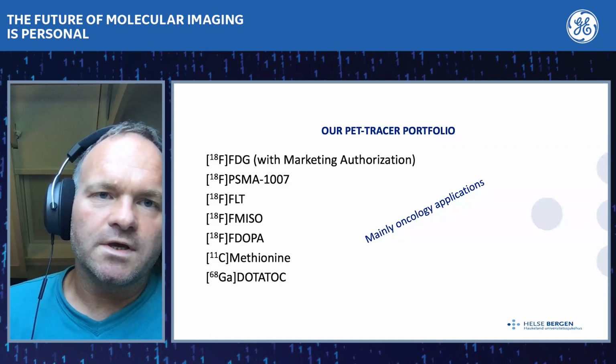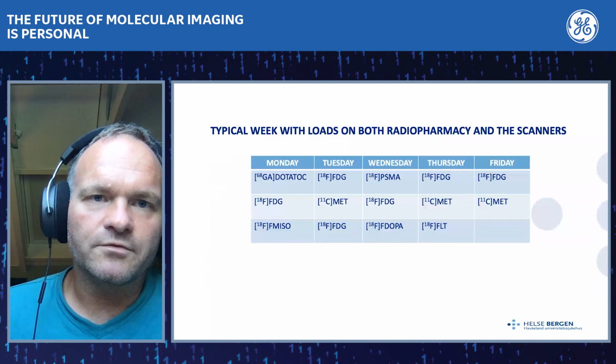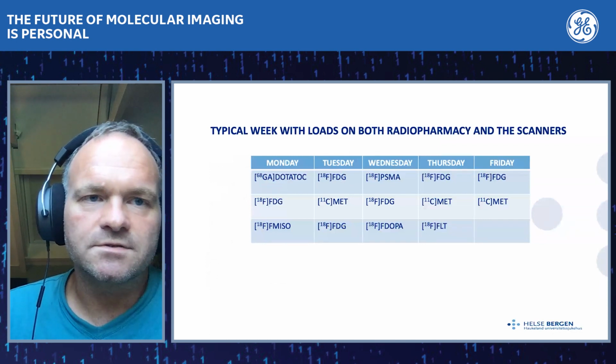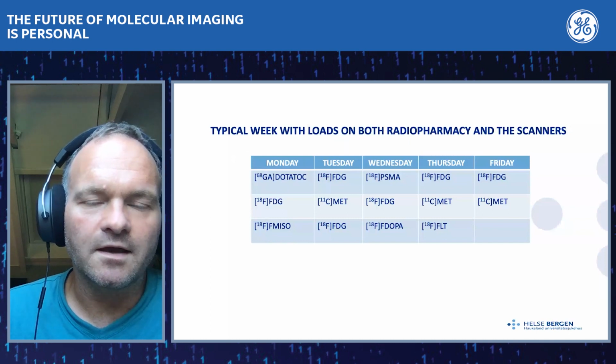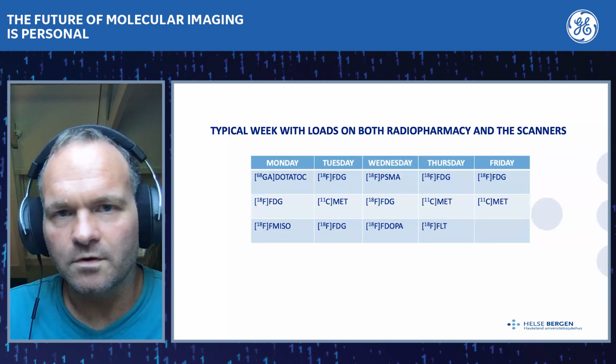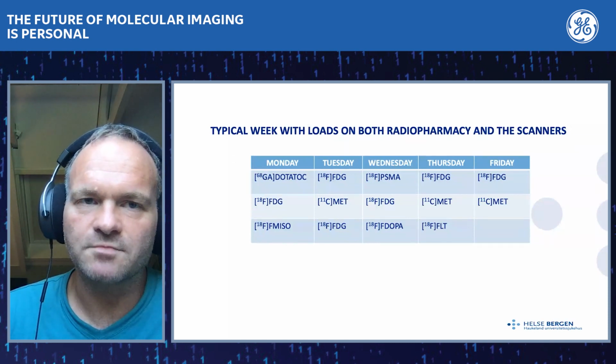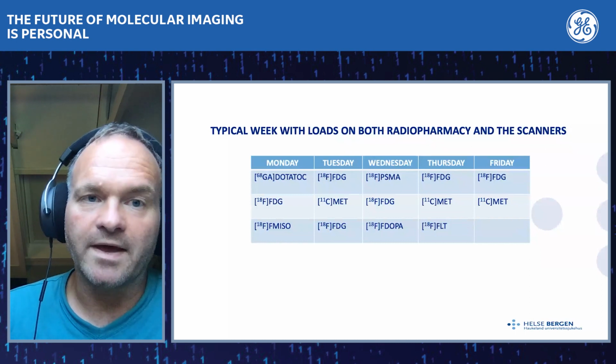So a typical week, looking at the load on the radiopharmacy and the scanners, we can see that every day we use the synthesis modules to capacity.